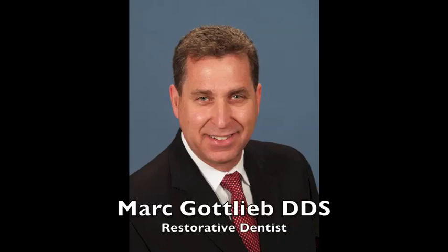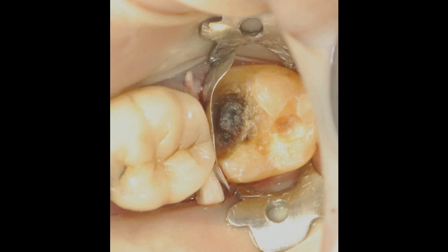Hello, I'm Dr. Mark Gottlieb, here to demonstrate how to restore that large class II lesion with the wide open box or missing cusp.